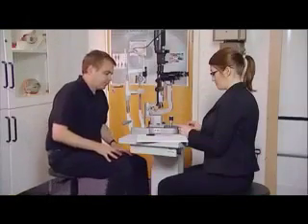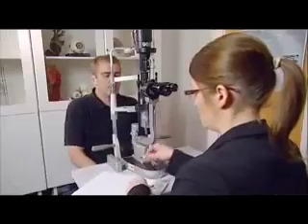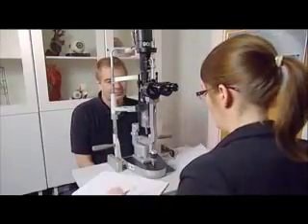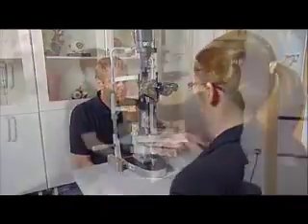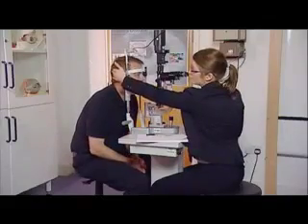To perform the test, the patient is seated comfortably in a room without excessive illumination, then positioned at the slit lamp.